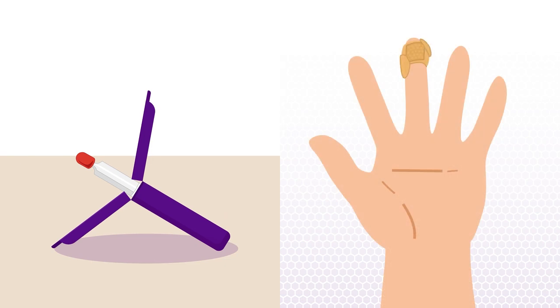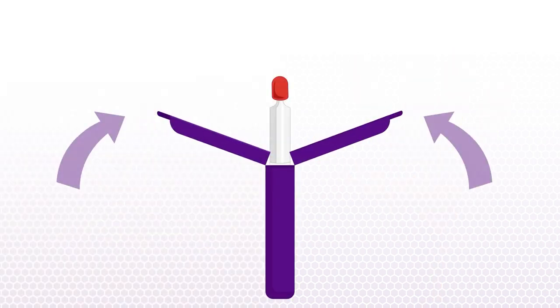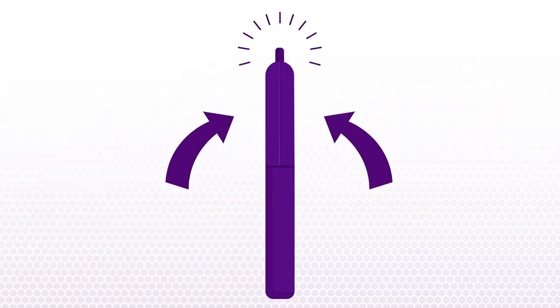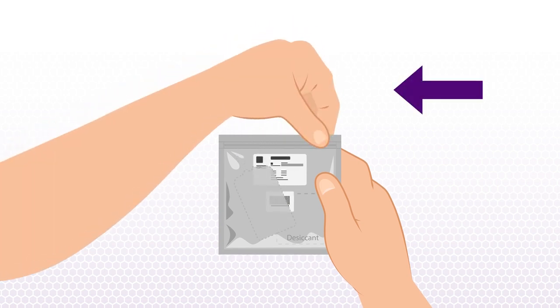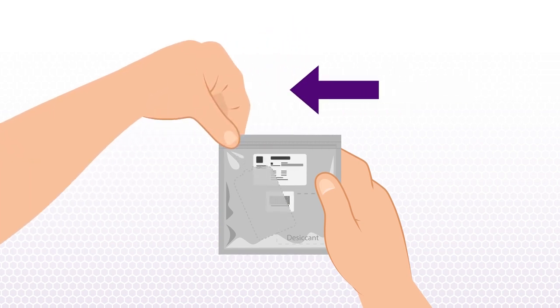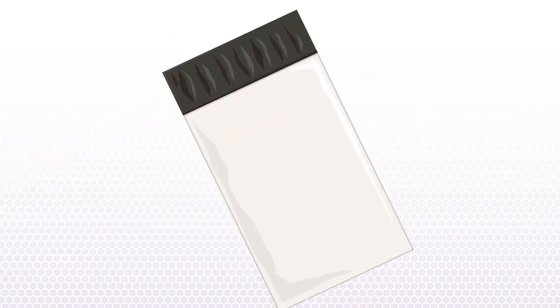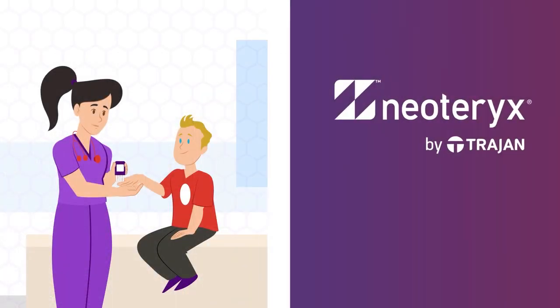Once you've collected all of your samples, put the Mitra device down and bandage your finger. Once you've finished, close the Mitra device, place it in the specimen bag with the desiccant and seal it. Put the sealed bag in the shipping envelope and your samples are ready to ship.